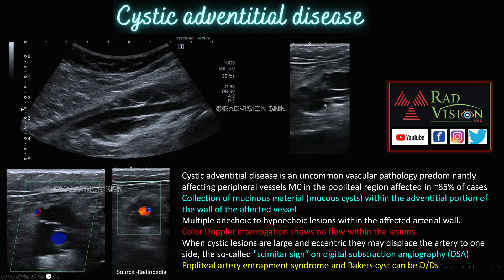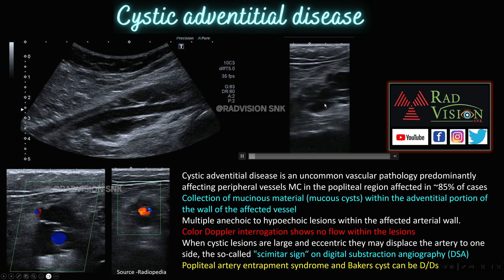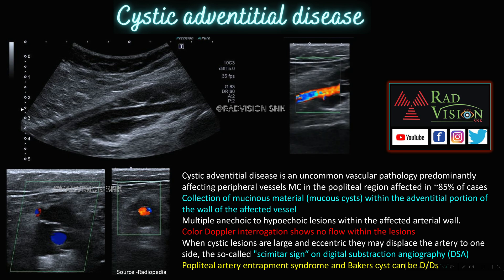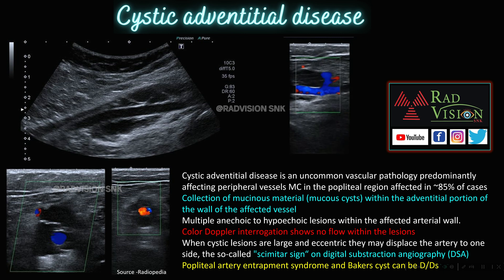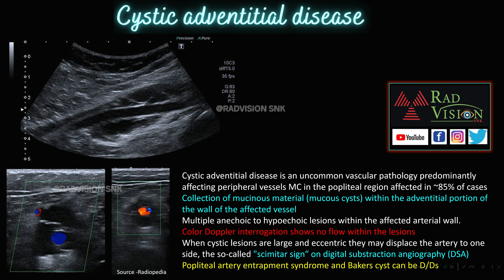Next case: here you can see this is the popliteal region, this is the popliteal artery, and there are multiple cystic spaces surrounding the popliteal artery. Here you can see the artery with multiple cystic areas adjacent to it. On color Doppler, you can see the popliteal artery flow pattern, but the multiple cystic spaces adjacent to the artery are not taking up color. These are nothing but multiple mucous cysts in the adventitial wall of the affected vessel. This is common in the popliteal region — definitely suspect cystic adventitial disease.